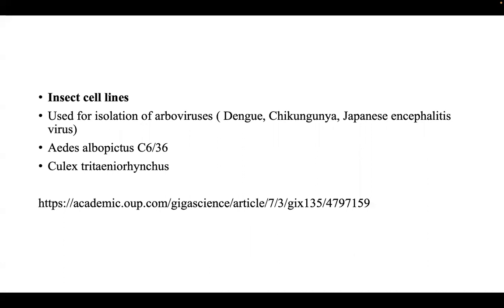So why are tracheal rings used to culture coronaviruses? It all goes back to where the coronavirus infects, and on which cells it would grow better. You know the infection sites for the coronavirus, right?